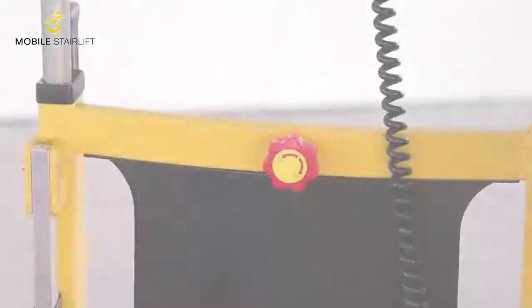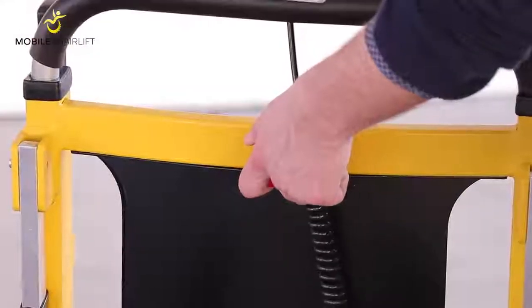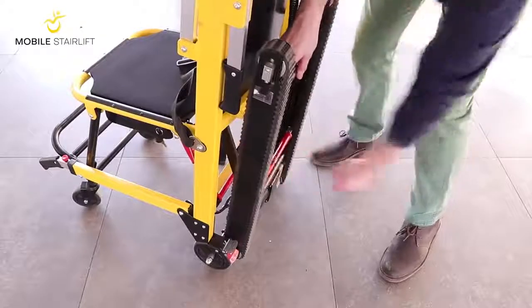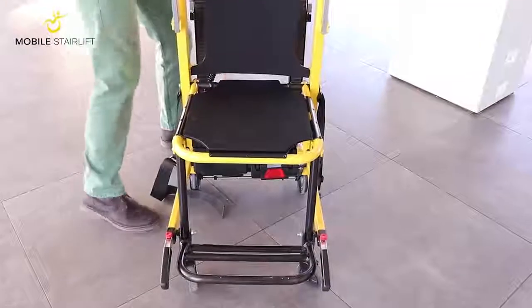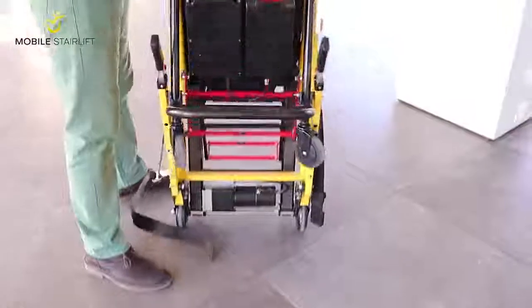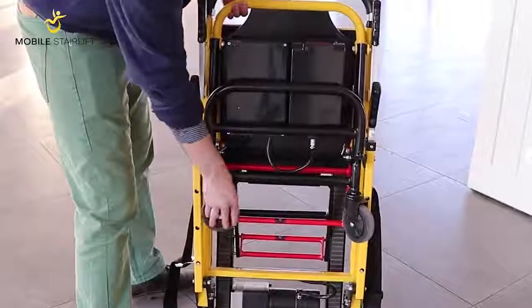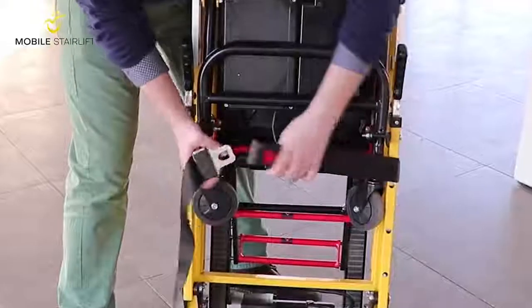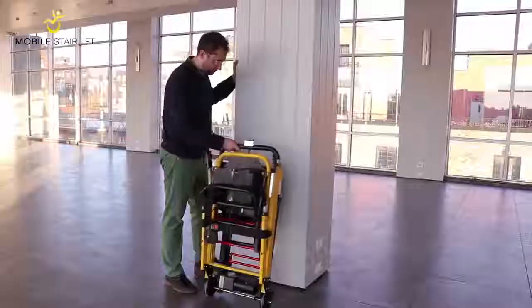To return the stair lift to a folded position after use, rotate the red knob and slide the handlebar all the way down the back of the stair lift. Fold the tracks up and lock them into place. Pull the inner red bar towards the arrow while leaning the back of the seat forward, then fold the seat up. Fold in the footrest and make sure the wheels are flat against the front. Finally, fasten the seat belt around everything to hold everything in place. The chair is now ready to be stored or transported.